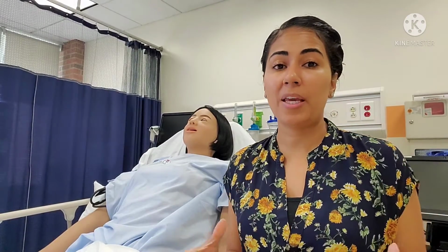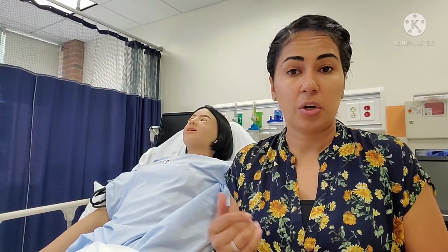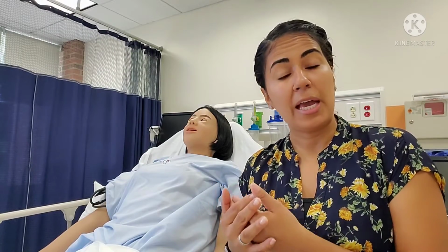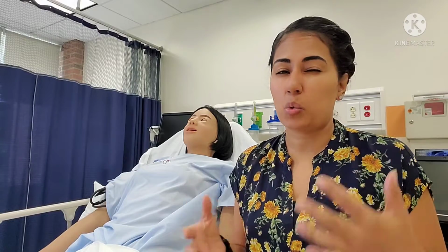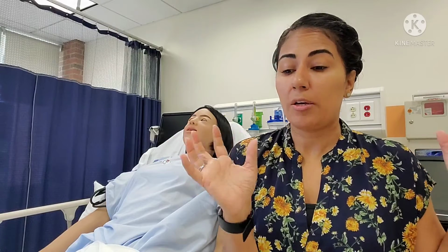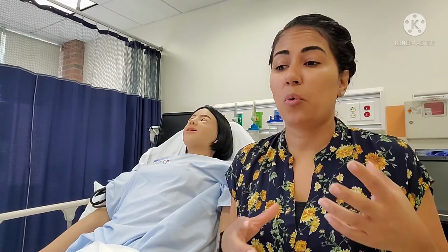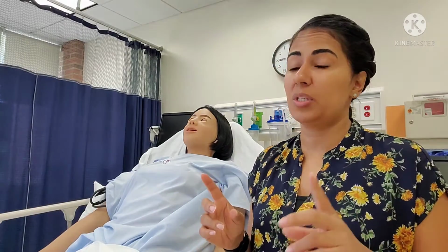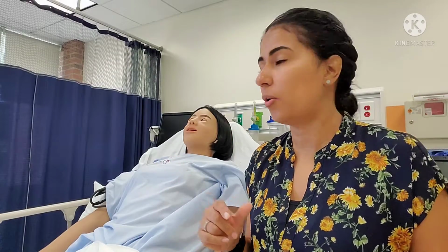Okay. So depending on your provider's order, your chest tube might be to suction, okay? Patient's chest tube is on suction. I want to make sure that I review the order and see what the order is for. Typically it's about 20 centimeters of water suction. Depending on if I have a dry suction system or a wet suction system, I'm going to be assessing it differently. Today I'm going to show you a dry suction. I'll do another video on dry versus wet, so this one isn't too long, okay?